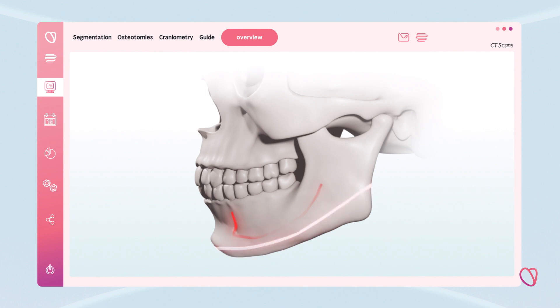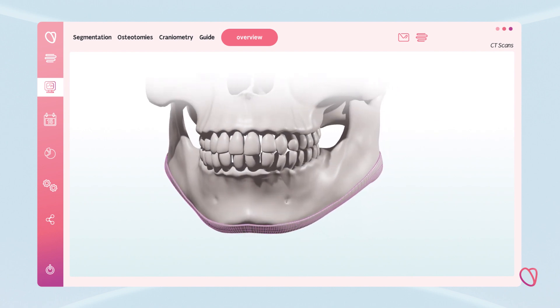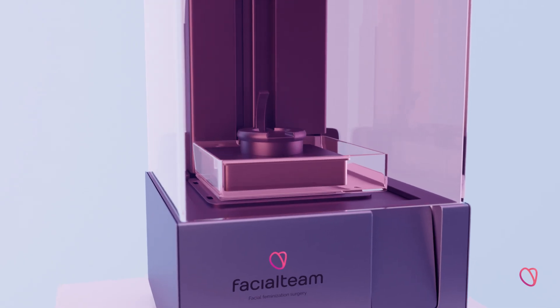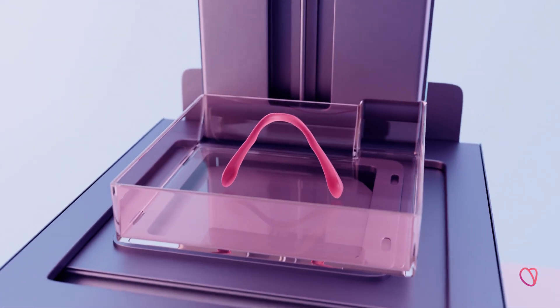This will reduce dramatically the risk of nerve damage during jaw and chin recontouring. Finally, a 3D cutting guide is generated and printed for later use in the surgery. This is the most reliable method to transfer the virtual planning to the real surgical intervention.